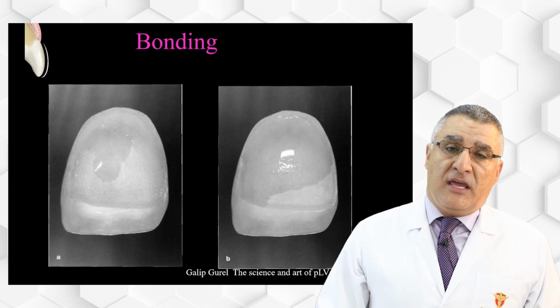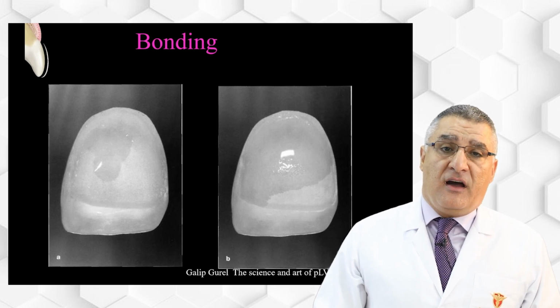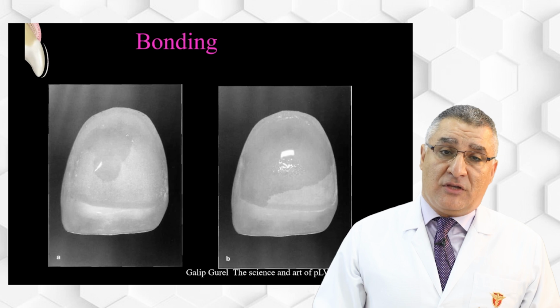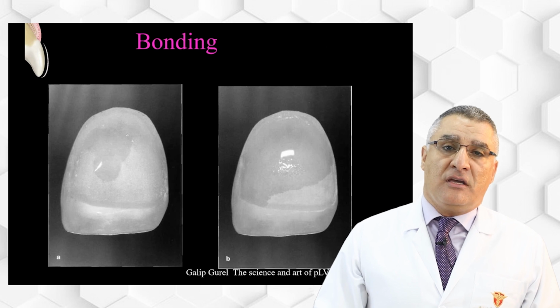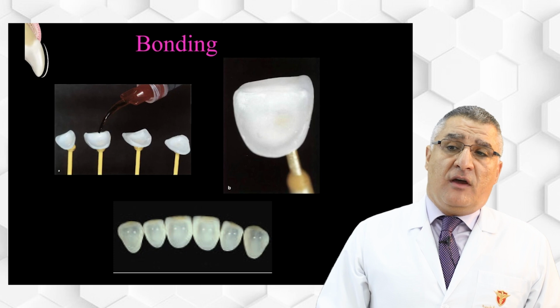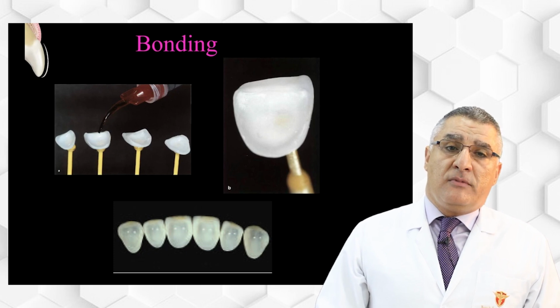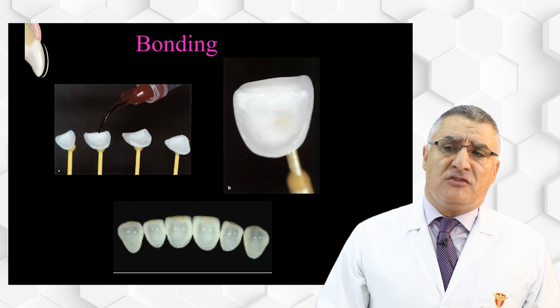If it is pre-etched and you try it in the patient's mouth and it is contaminated, there is no need for re-etching. You can use phosphoric acid for cleaning. Phosphoric acid will not affect the ceramic surface; it does not etch. We use the phosphoric acid for the purpose of cleaning the fitting surface if you try it and it is contaminated by saliva. After etching, we have to place the silane coupling agent on the fitting surface.